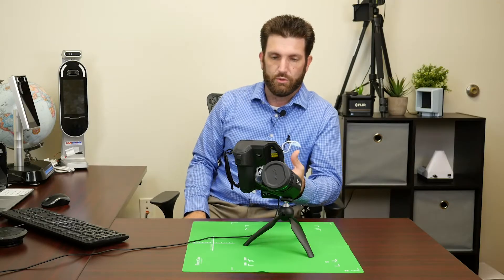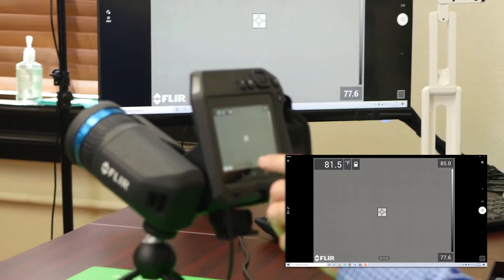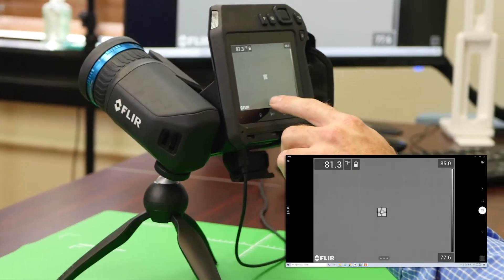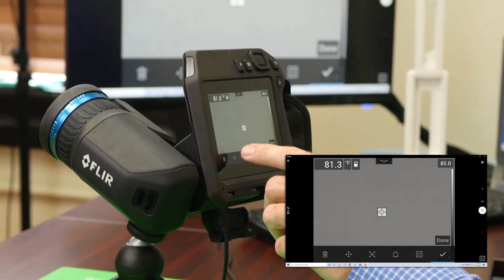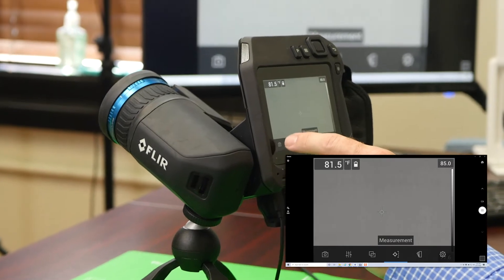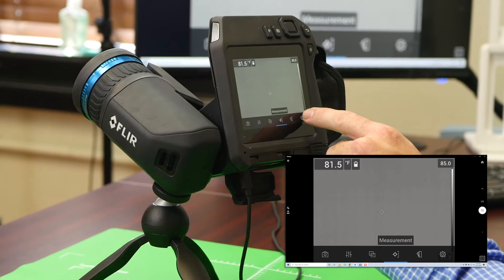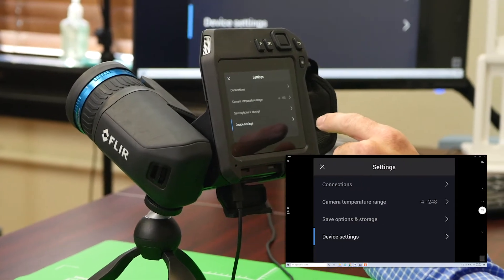From this point, what you need to do is engage screening mode. It does not come out of the box with it turned on. So what you'll need to do is click on the three dots you'll see in the middle of the screen. That will bring open the settings menu. In here, you'll see numerous different options. You're going to go all the way to the right where you see the settings wheel, just like you would on any other tablet or device.